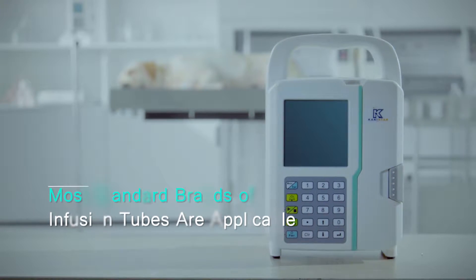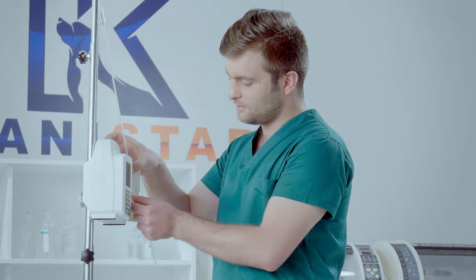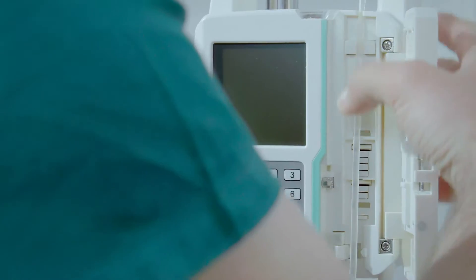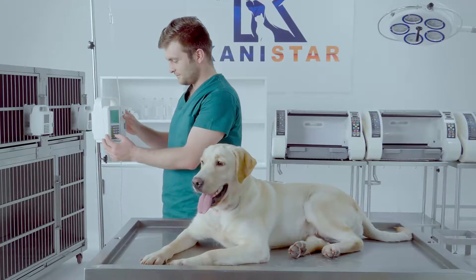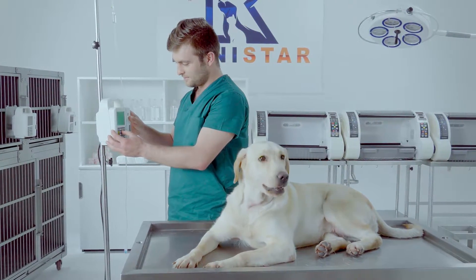Most standard brands of infusion tubes are applicable. The LP1900 has a large preset library with the majority of tubing lines on the market stored in memory, helping users set up lines with just a few simple steps and clicks.